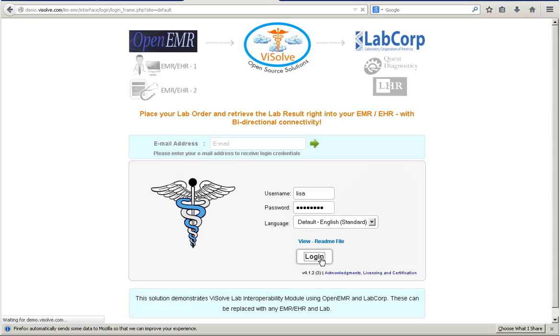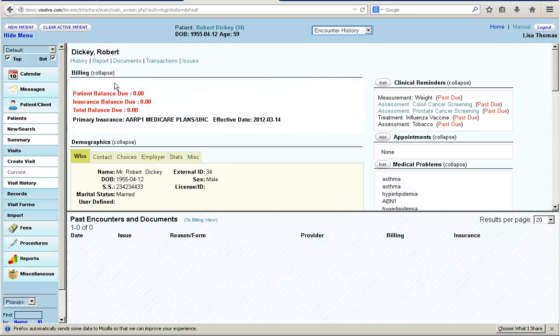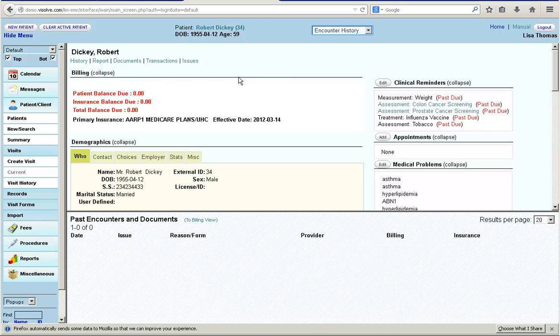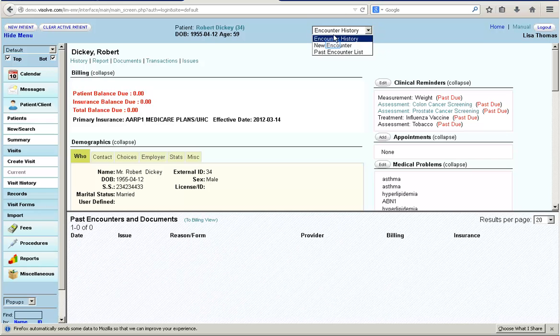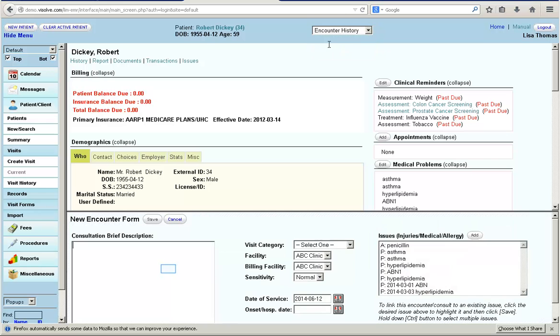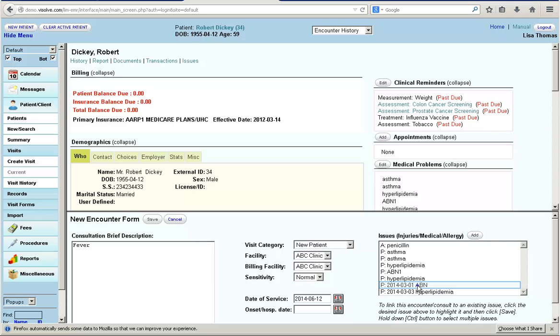Dr. Lisa logs into the application. She selects the patient and creates a new encounter for the patient. Then she enters the consultation brief description, selects the visit category and issues, and saves the encounter.